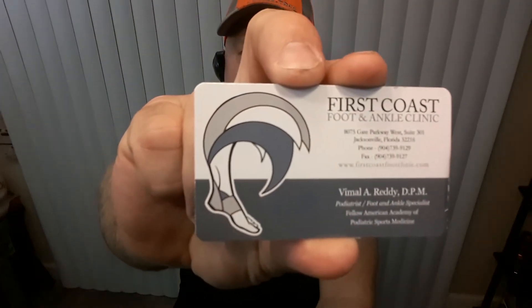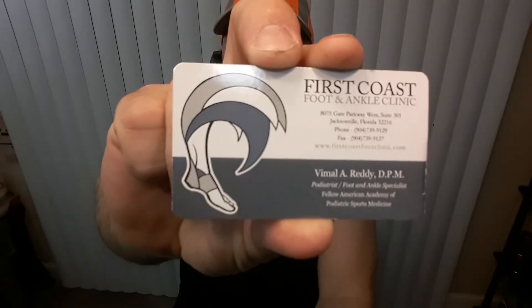I was actually on the way to the chiropractor and someone noticed I was trying to stretch my heels and calves out. He told me he had the same problem and he sent me here — it's First Coast Foot and Ankle Clinic. Dr. Reddy is a foot and ankle doctor, and they told me about this EPAT.